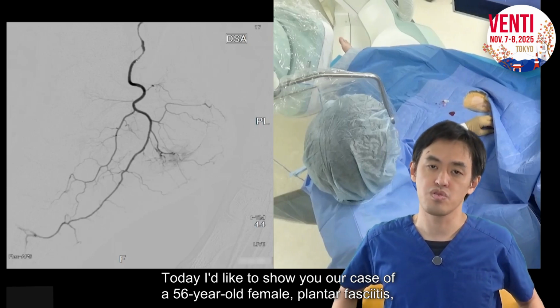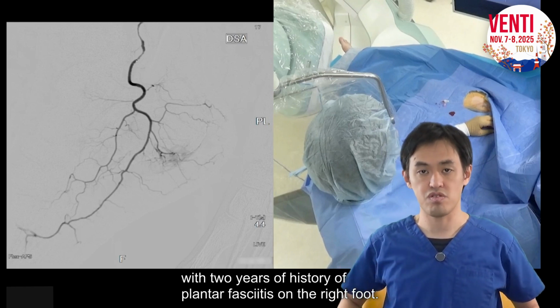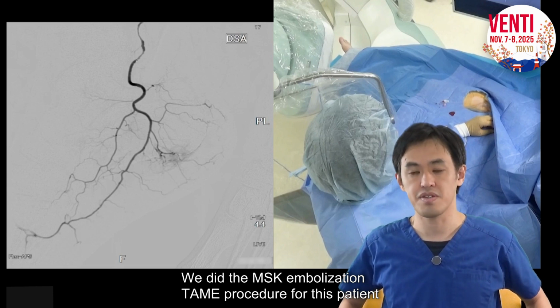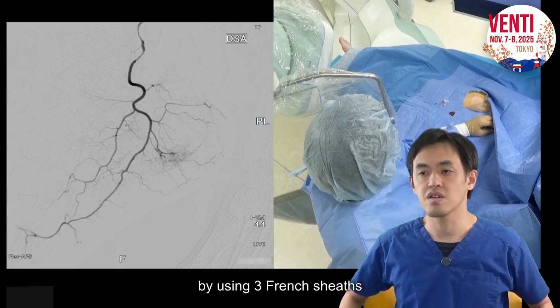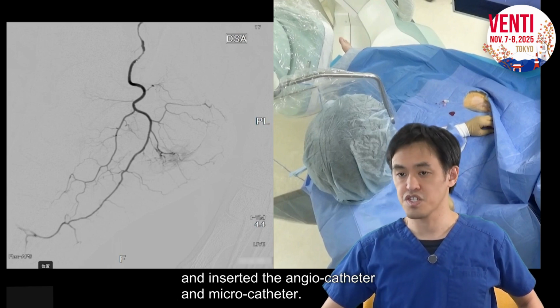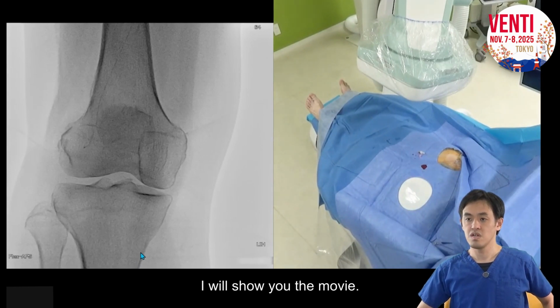Today I'd like to show you our case of a 56-year-old female with a 2-year history of plantar fasciitis on the right foot. We did the MSK embolization procedure for this patient by using a 3 French sheath on the ipsilateral antegrade puncture from the right groin and inserted the angiocatheter and microcatheter. I will show you the movie.